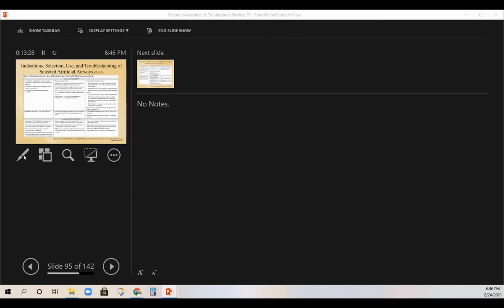If breath sounds are not heard or the stomach is distended, remember, you're going to choose this choice. Okay? The stomach is distended: remove the tube, oxygenate, and reintubate. And make sure you do not withdraw more than 1 to 2 centimeters, or you're going to have to reintubate, okay?